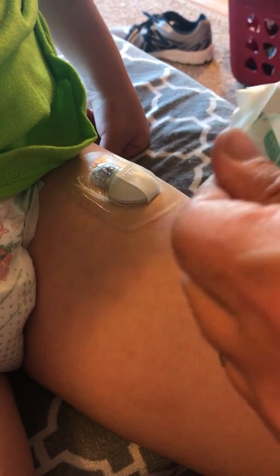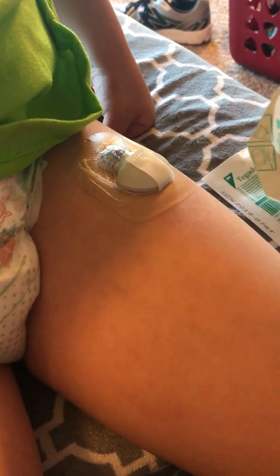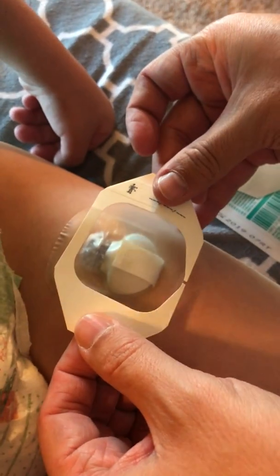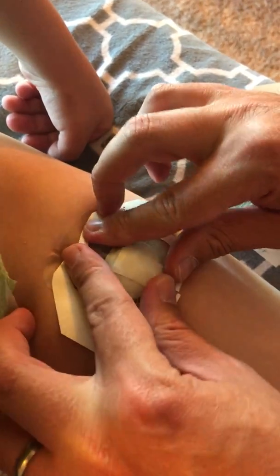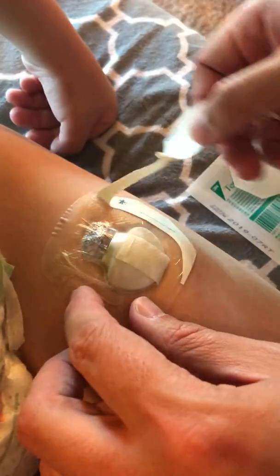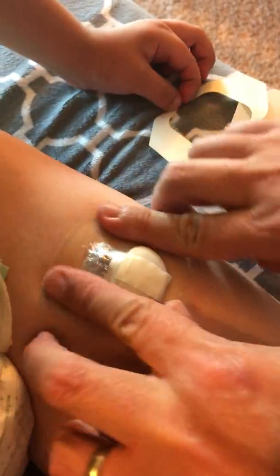This is just kind of a final coat that we put on to make sure it stays on. This one he doesn't have as bad of an allergic reaction, but the bulk of it will go over the sensor itself. So you just kind of put it in the window there, press it down, and then peel the white part off around it. And then you peel that spot where the white part was.